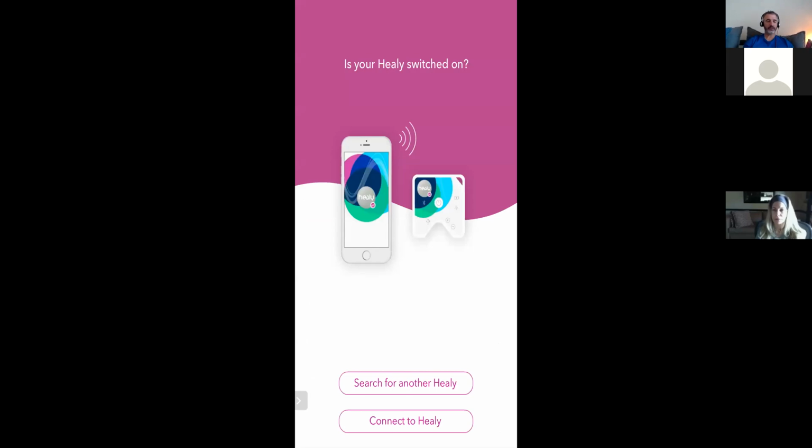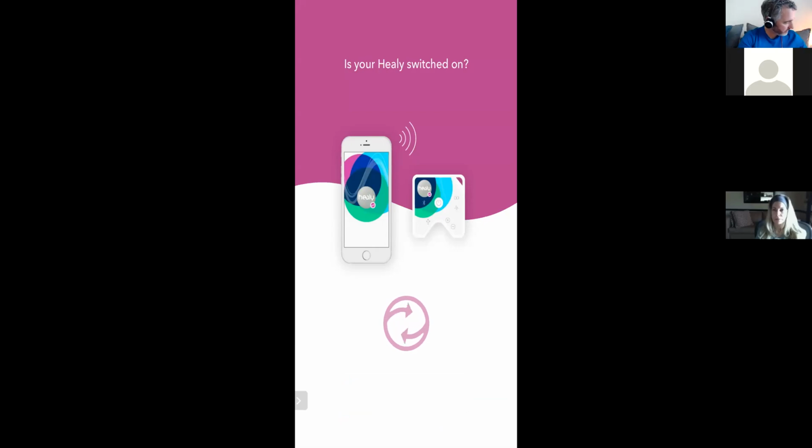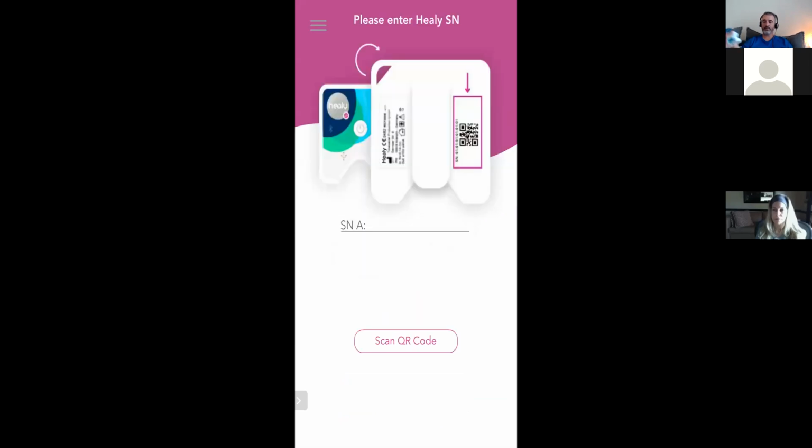Typically I search for another Healy, and then I would run the scan on it. For example, I have one of my dad's Healys that needs to be warrantied because the plug on it broke, right? So if I did that, there's the code on the back, okay?